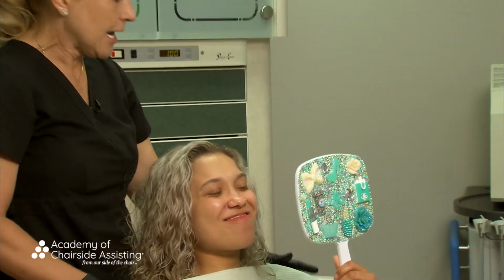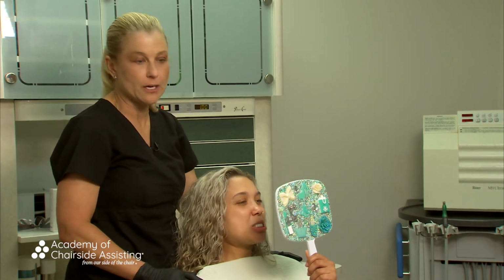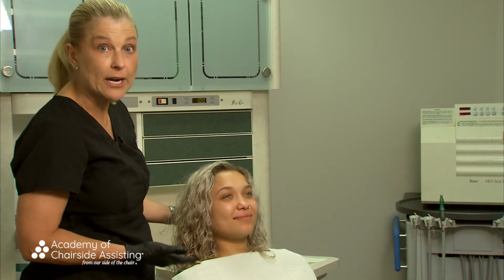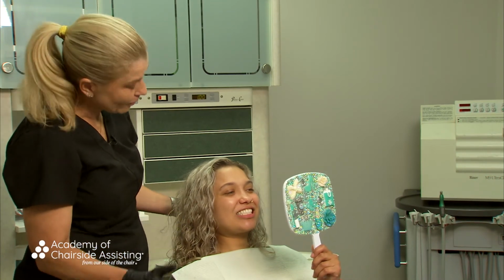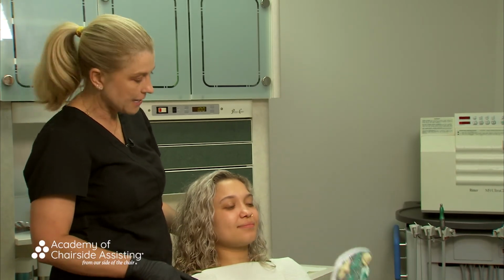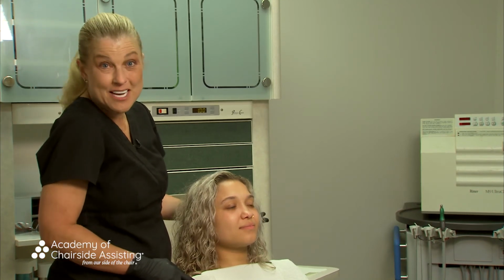I will say that, ideally what I would tell patients is once they take these trays out, brush your teeth really good, get all of the gel off of there. But it's critical here that even though we see already a good, it's already starting, right? It's already working. We've got a good shade already showing up here within just 20 minutes. I want to make sure that she knows that we have to continue the whitening process every day. Don't skip a day, okay? Every day. 20 minutes, that's nothing, right?